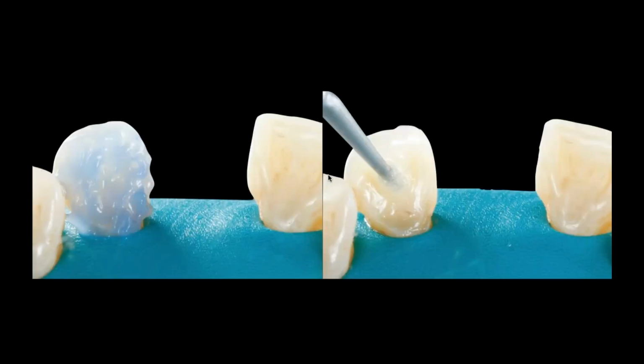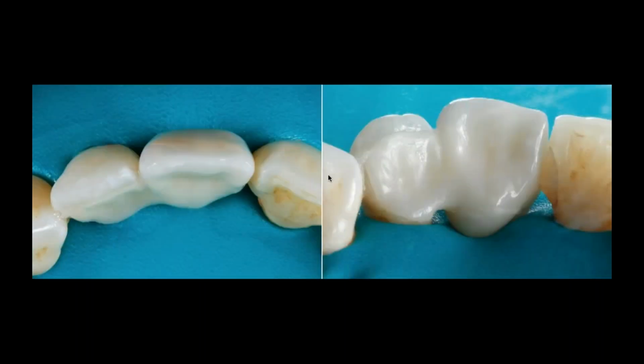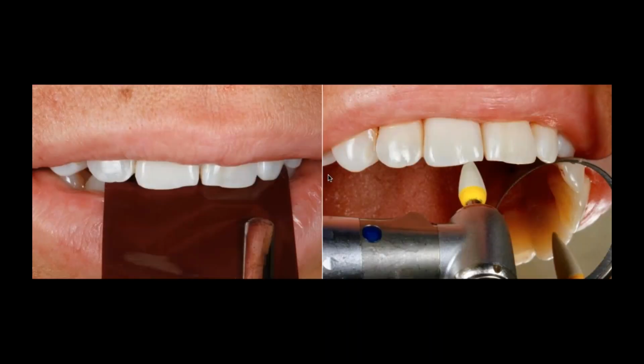On the area of the tooth: rubber dam, phosphoric acid etching, adhesive to the surface, and then the final cementation. Always rubber dam isolation, it will help us control everything. I would keep the margin of the preparation slightly supragingival in the palatal aspect to facilitate the placement of the rubber dam and the final cementation of this type of variation of Maryland bridges.